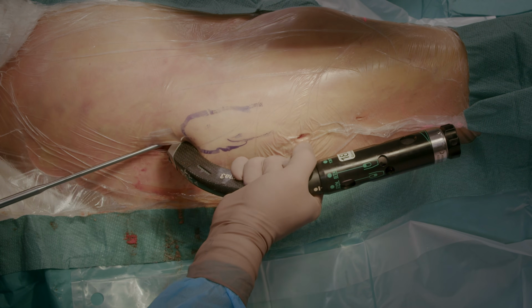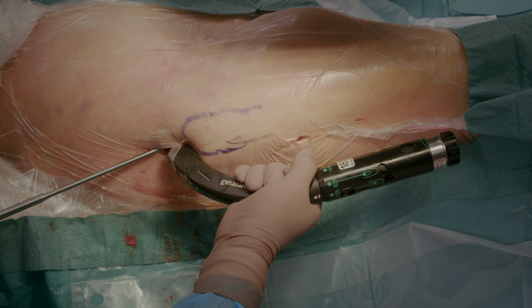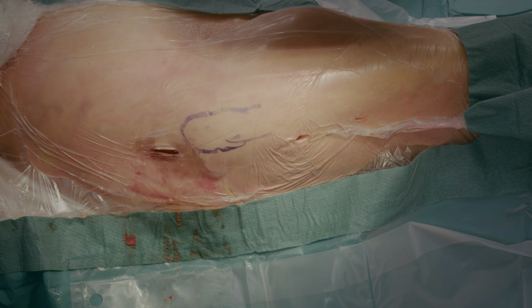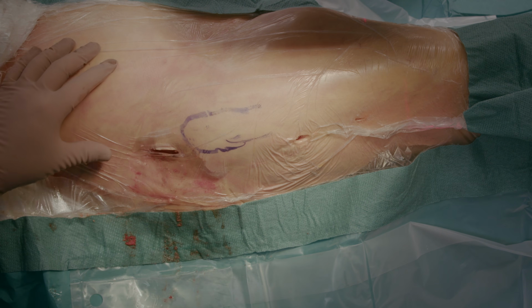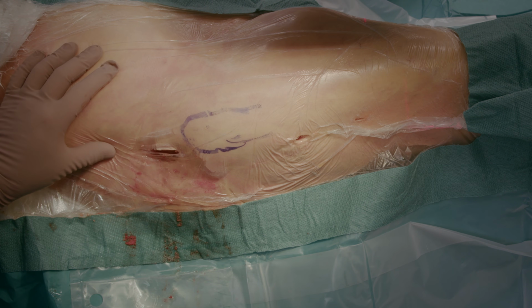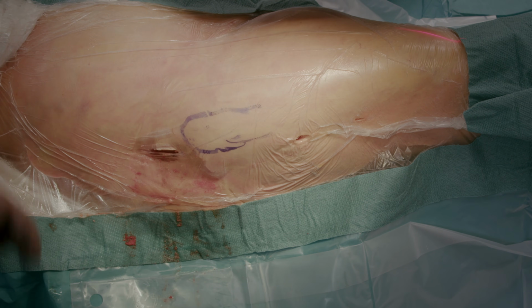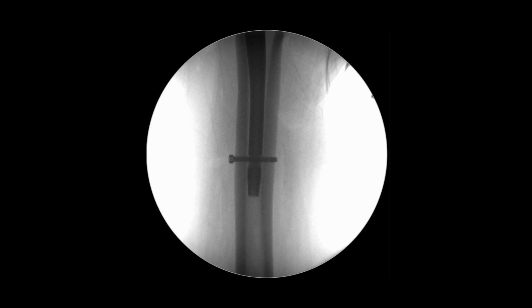Now remove the target device, like this. The limb traction can be released, and we can obtain final fluoroscopic images. First, the distal part of the nail. Then we move proximally.